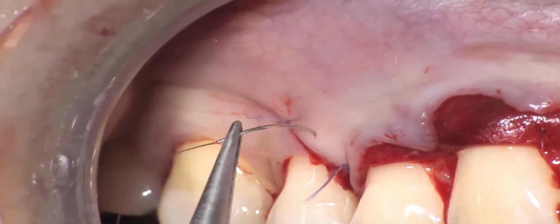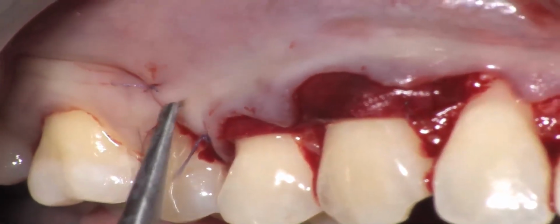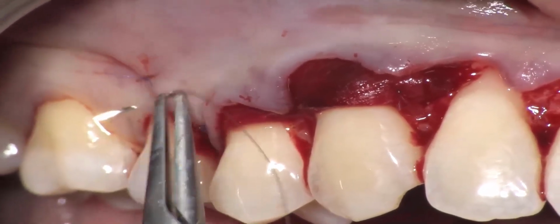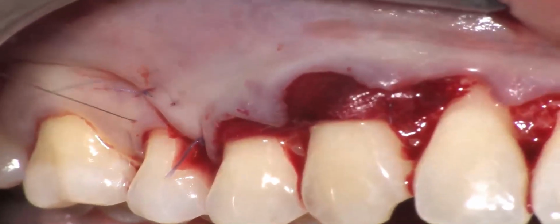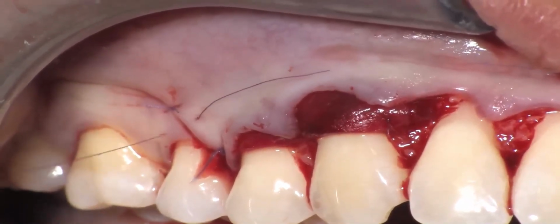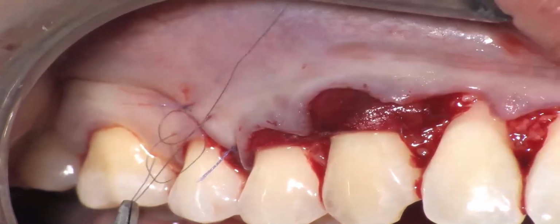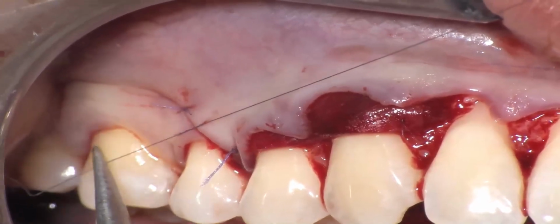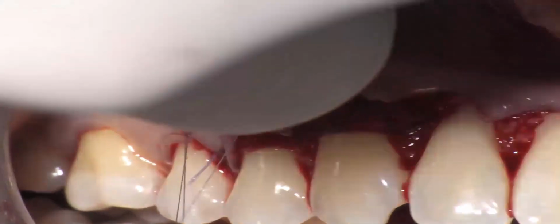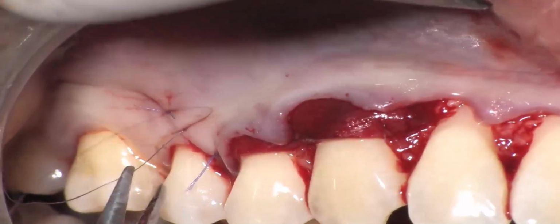Again, from the flap to the adjacent soft tissue, covering completely the blood clot. But leaving as much as possible of the blood above the root so that the material can work to increase the soft tissue thickness.